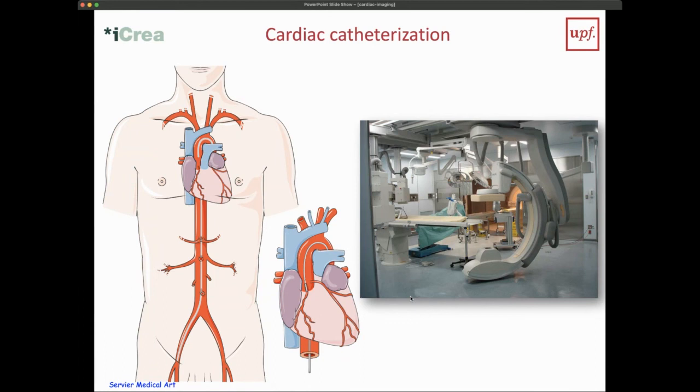And we will see that especially the proximal part, so the main part of these arteries, we can actually image with CT. But still, to get the best resolution, to go really in the order of tens of micrometers, then we need to go to projection X-ray imaging. And then again, because X-ray imaging is not able to discriminate blood from tissue, we need to use contrast agents.